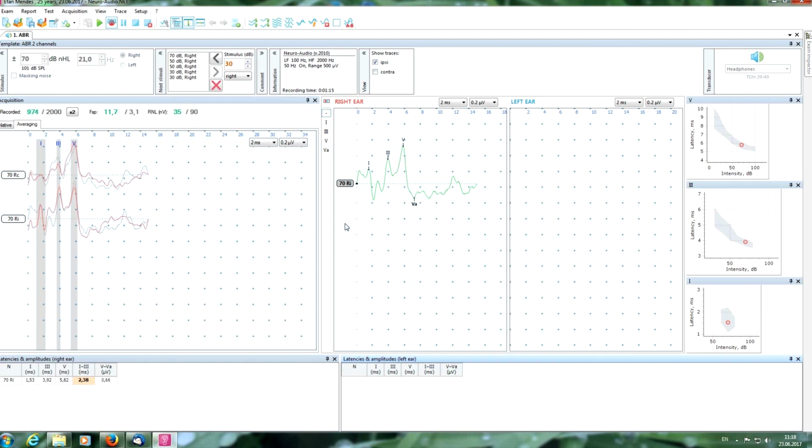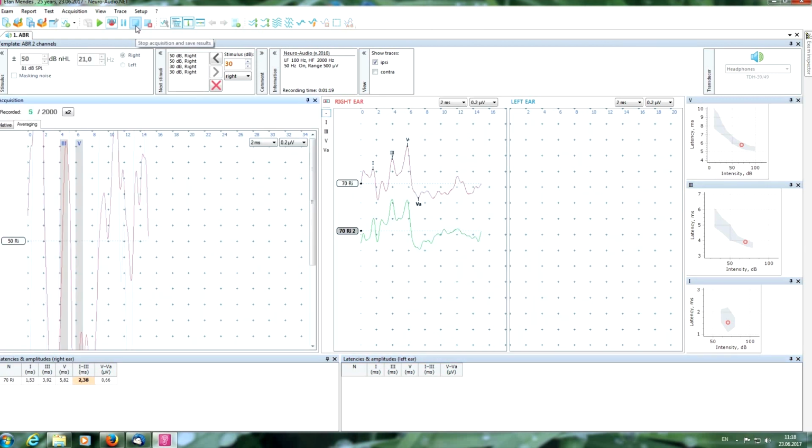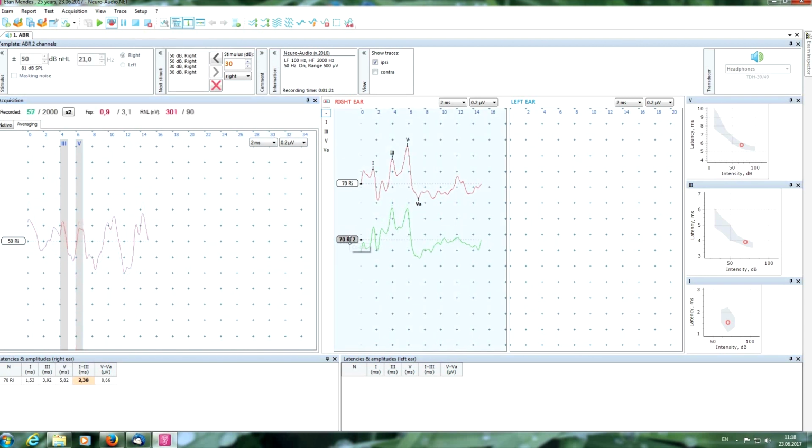Now we get the second response. It is good, with high reproducibility, as you can see. We can manage the second curve and put the markers. If we want, we can also overlay our curves to check the reproducibility. Also, we can see main latencies and amplitudes here in the table and here in the graphics of normal data.